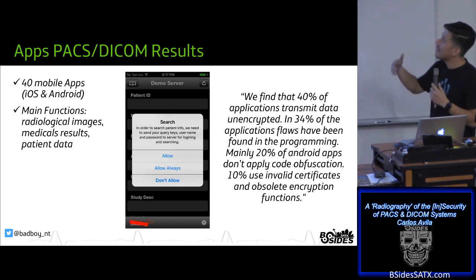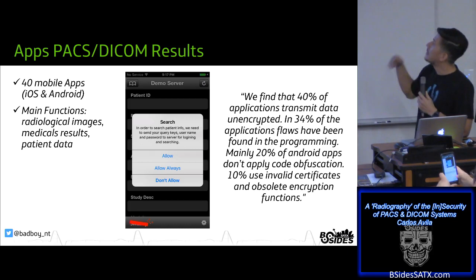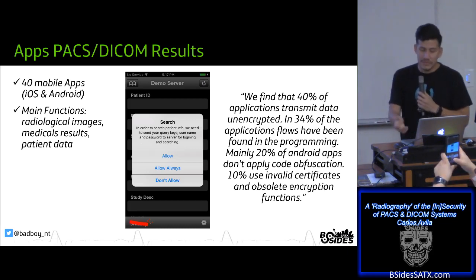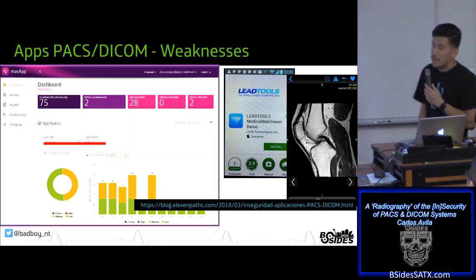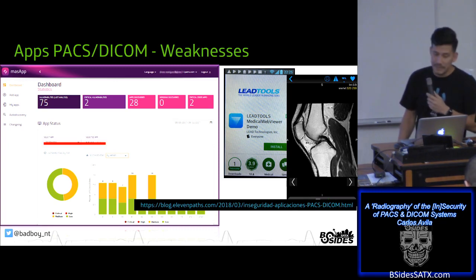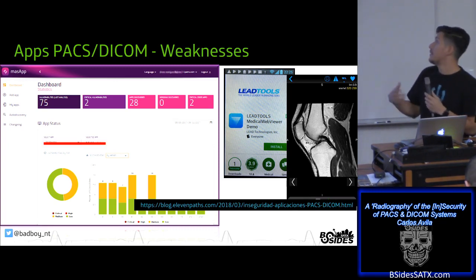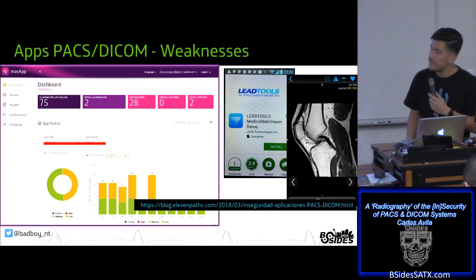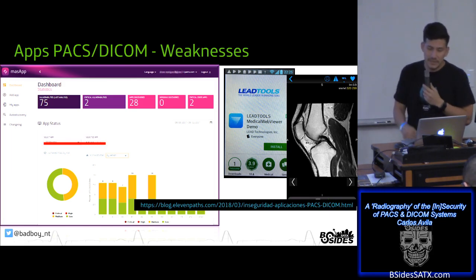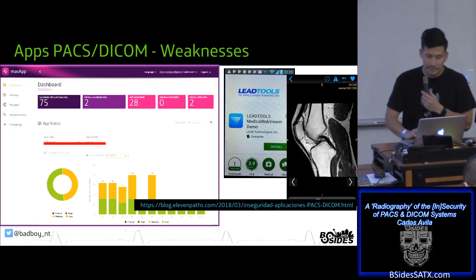These applications access medical services such as radiological images, medical results, etc. Through these mobile applications, a potential attacker could find flaws that allow escalating privileges on the healthcare infrastructure, for example. We have found common vulnerabilities, for example, obsolete certificates, SQL injection, cross-site scripting, hard-coded passwords, etc.